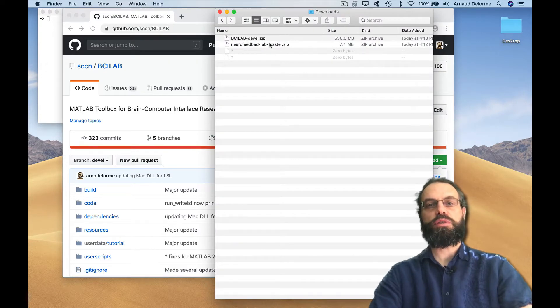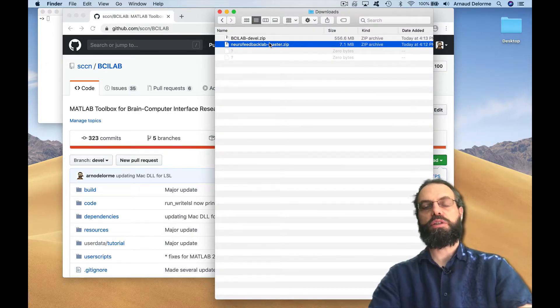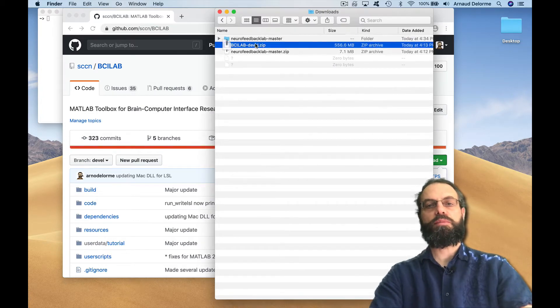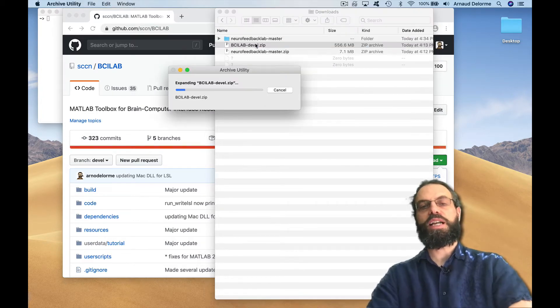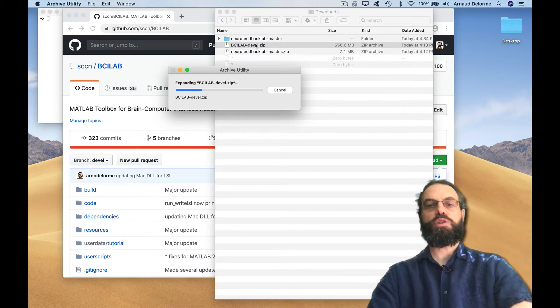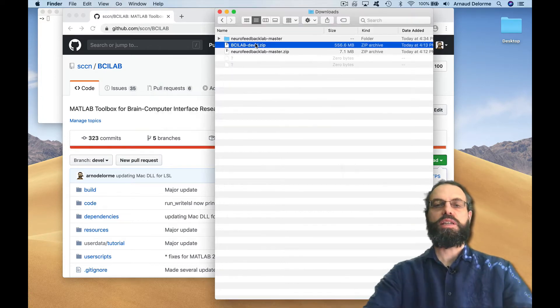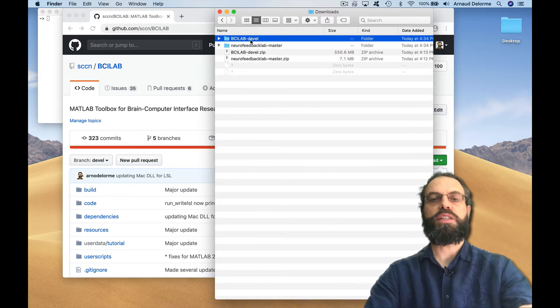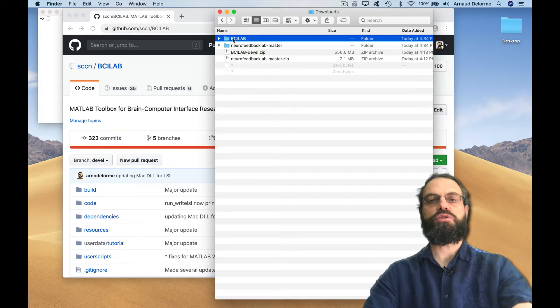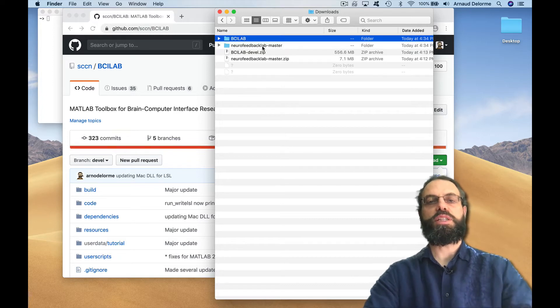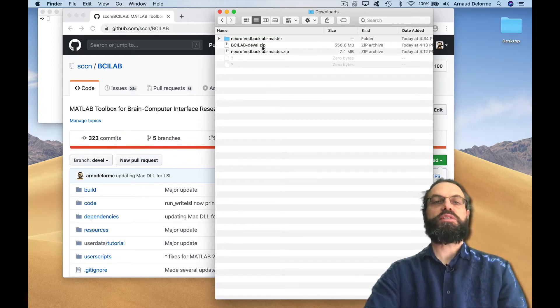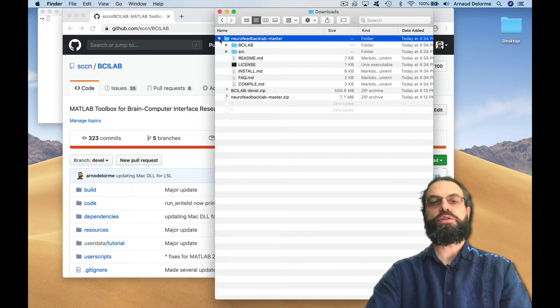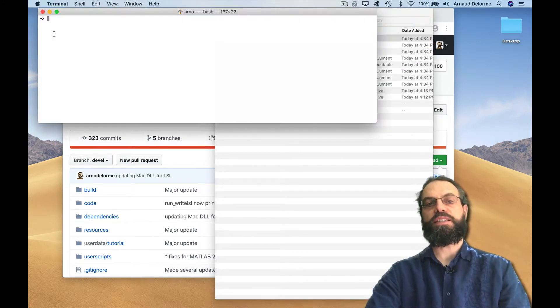In my download folder, we're going to unzip the Neurofeedback Lab program and unzip the BCI Lab program. Then we're going to move the BCI Lab program inside Neurofeedback Lab this way it's able to find it relatively easily. We have to rename it BCI Lab as well because it's usually expected to be named BCI Lab. So it's installed and ready to go.